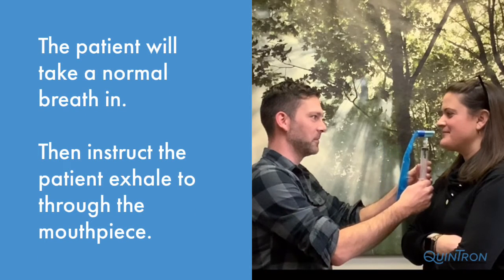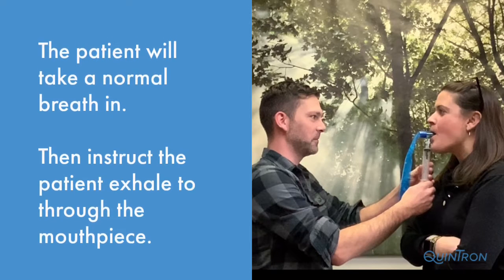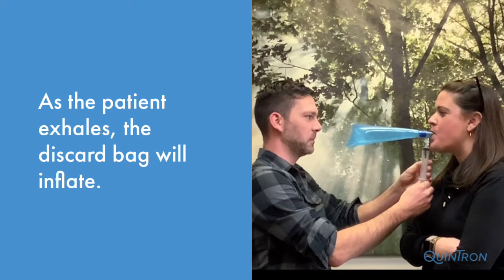To collect a sample, the patient will take a normal inhalation, place their mouth over the mouthpiece, and begin to exhale their single breath through the mouthpiece. As the patient exhales, the discard bag will inflate.